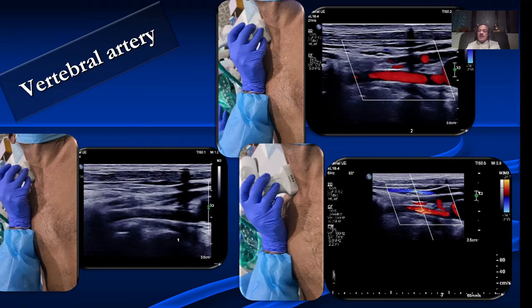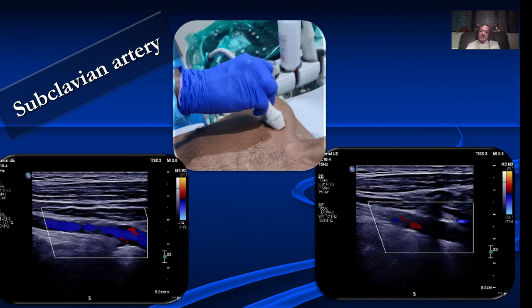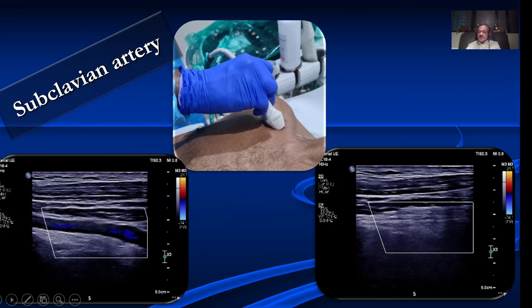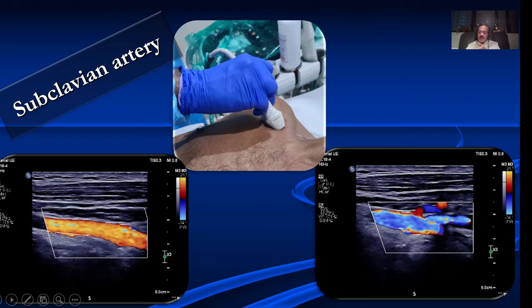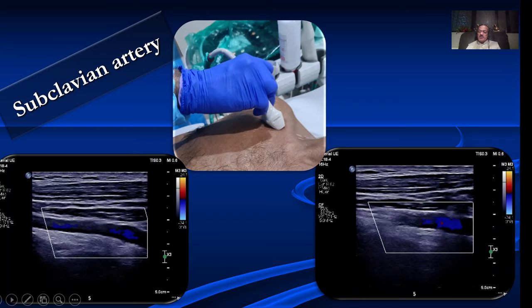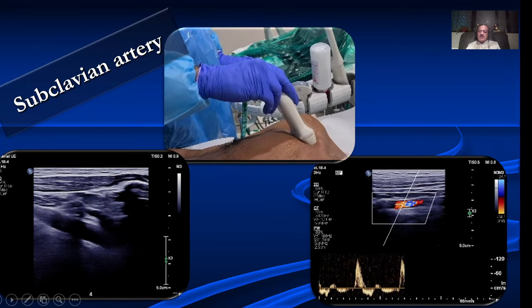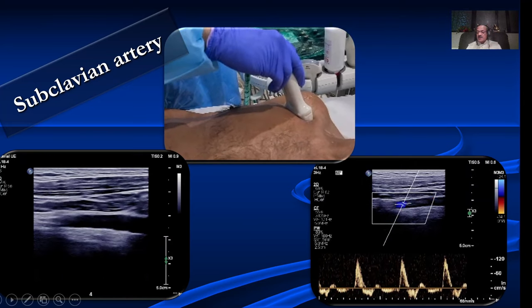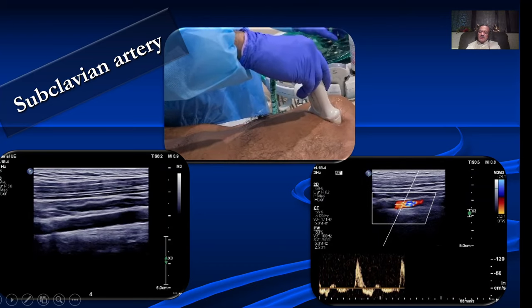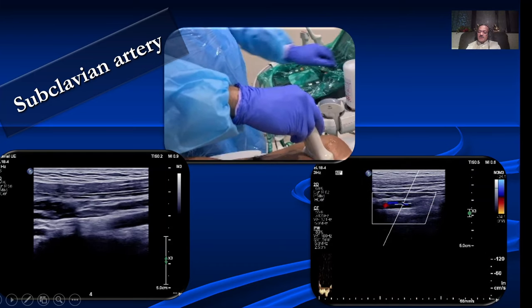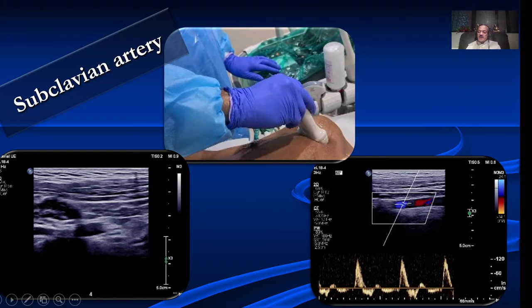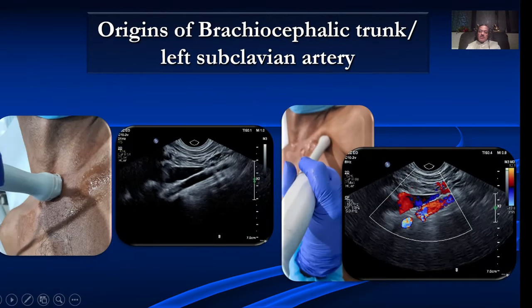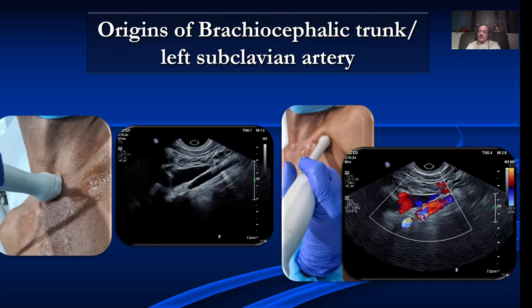Then, keeping the position the same, we look at the subclavian artery. We try to go as close to the origin as possible, tilting the beam towards the manubrium sternum in the proximal portion. As we go distally towards the axilla, we tilt the probe on the opposite side. The subclavian artery typically has a very high resistance waveform with reversal of diastolic flow, and you might get a little forward flow a little later.